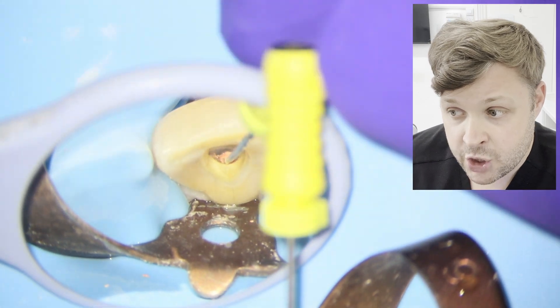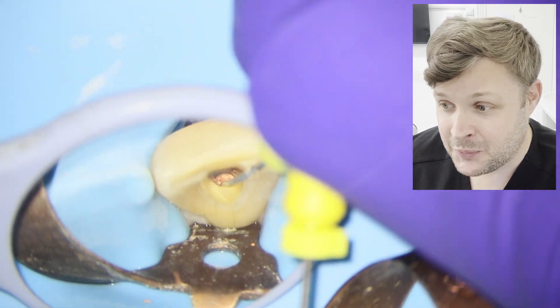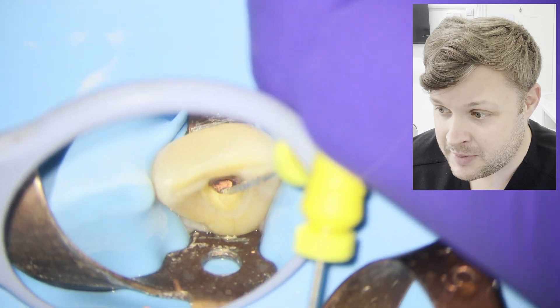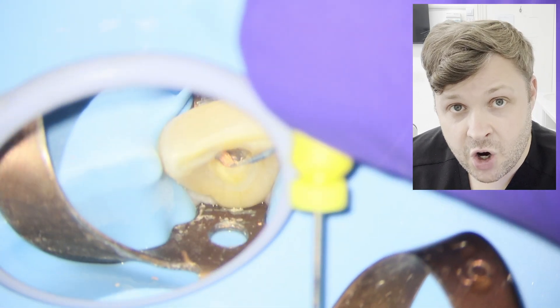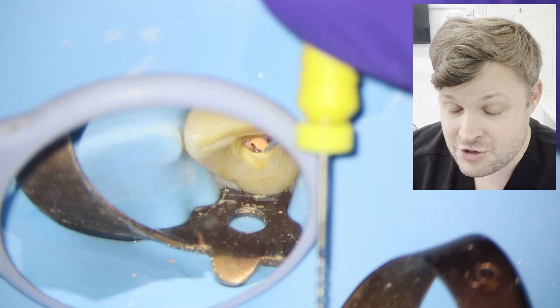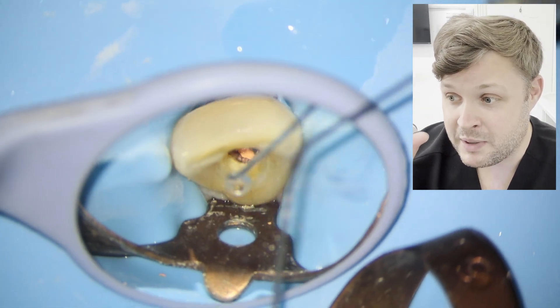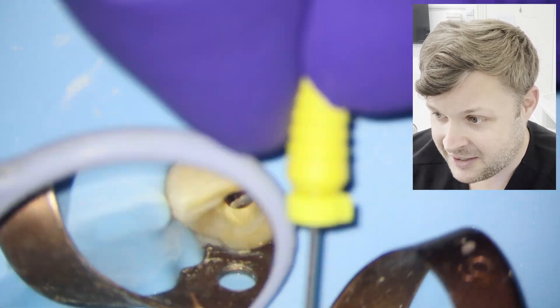I always make sure I make the patient aware that we're doing a lot of pulling and tugging with this GP removal. And probably the most satisfying thing in the whole of dentistry is when you screw in the H file and pull it out and the whole piece of GP comes with it — that's a very, very satisfying thing.